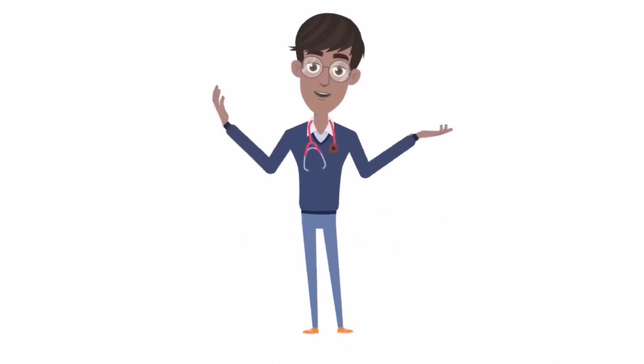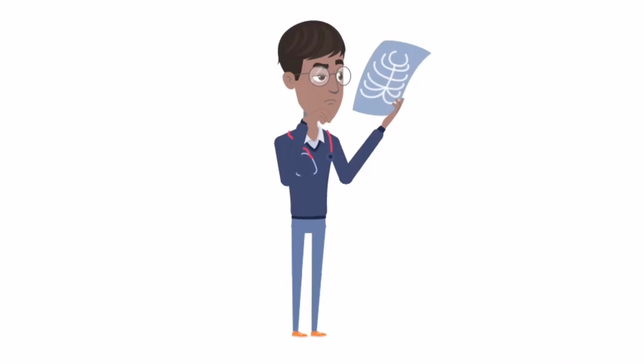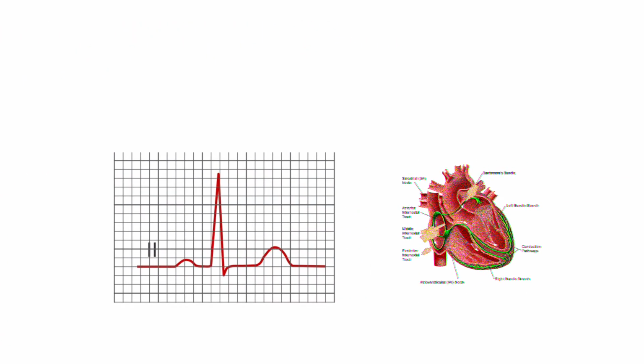As a director, I've decided to let you in on a little secret of how to interpret the various images I've captured so far. The best way to do this is to use Lead 2 and to reference my previous video on electrophysiology of the heart.